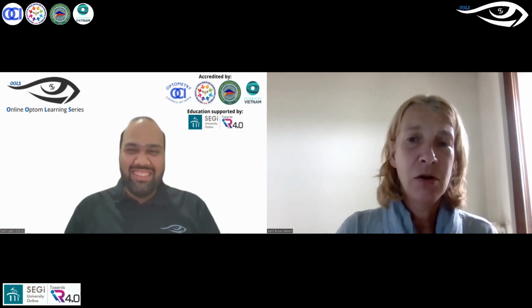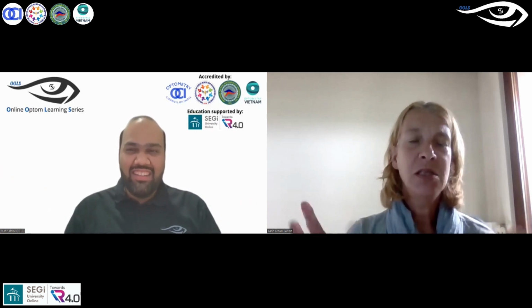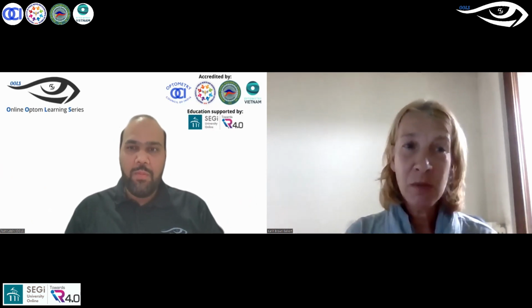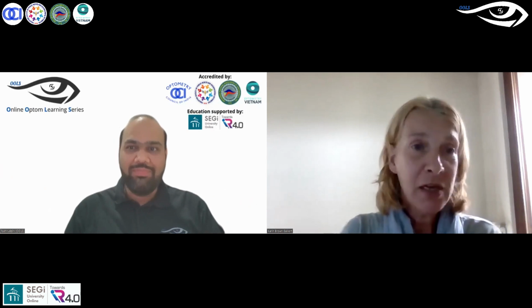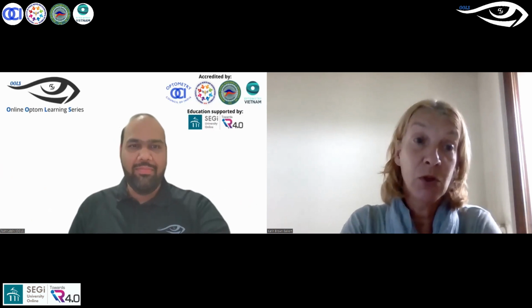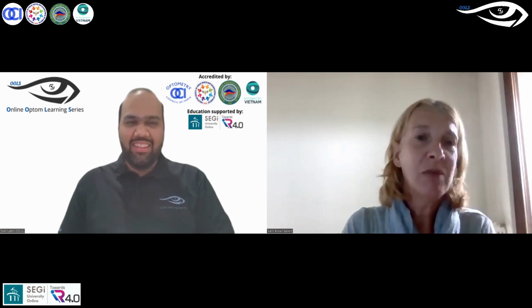Yeah. And I think you actually also see the difference in what the labs do now. Of course, there's many more freeform lenses available than there were 3-4 years ago. So the whole understanding is better. But of course, what are we going to do now we understand? We're going to have to get something like a freeform lens or more adaptable lenses where you can change the landing zone and the haptics as well.